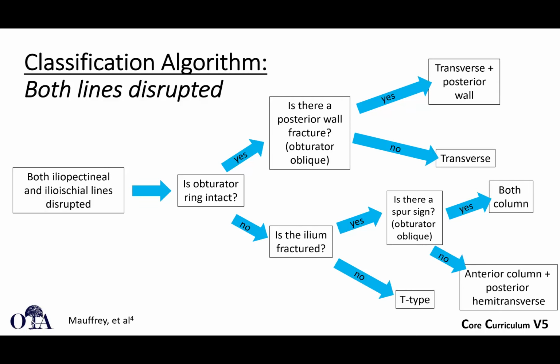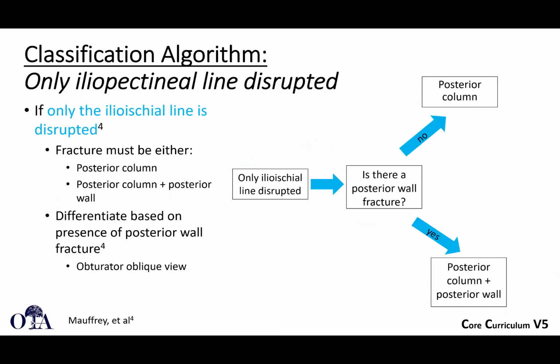So here's an algorithm to think about what I just went through. I won't go through all of this, but you can certainly pause the video and take a look and make sure this makes sense to you. I don't think this is something that you have to memorize. In the next several slides, we are going to show more of these, but I do think that this should make sense to you. You should go through this, and hopefully if you understand the fracture classification, then you can use something like this.